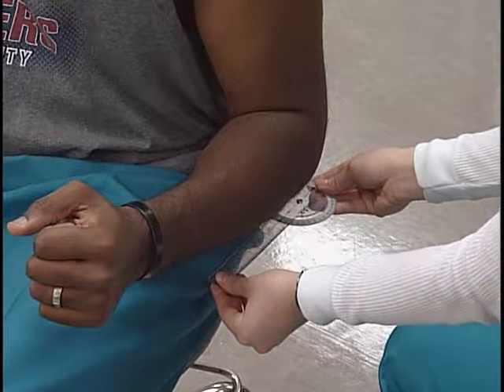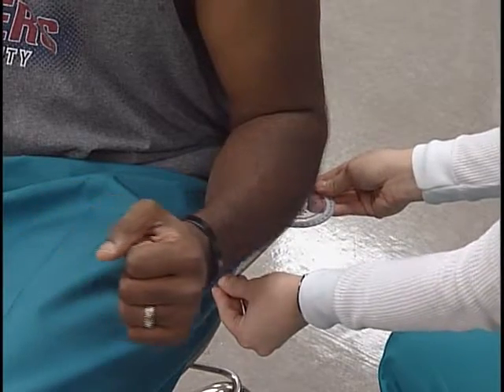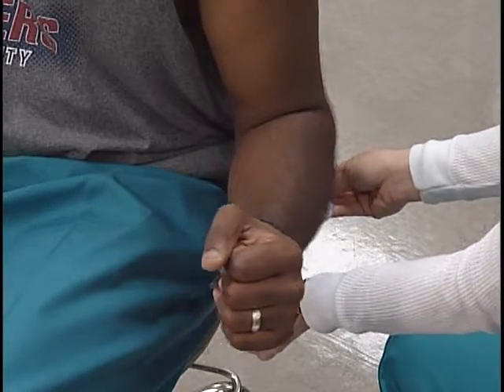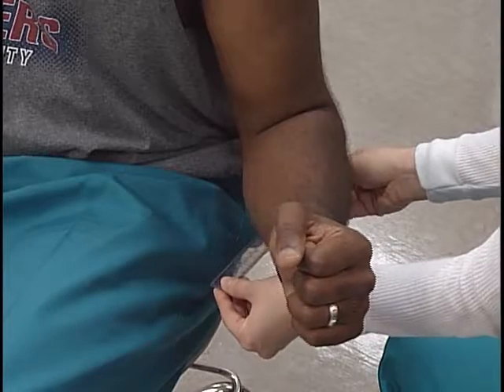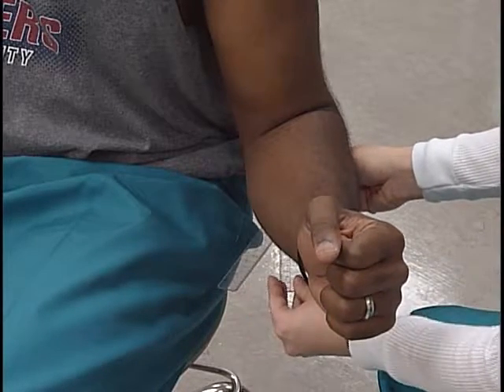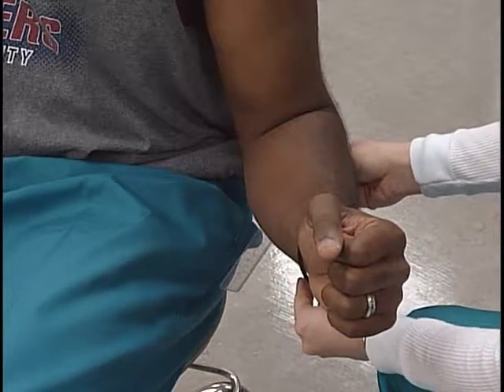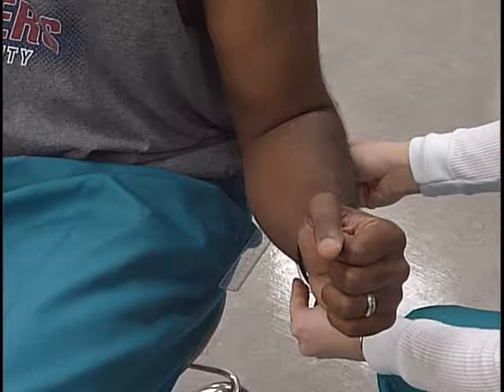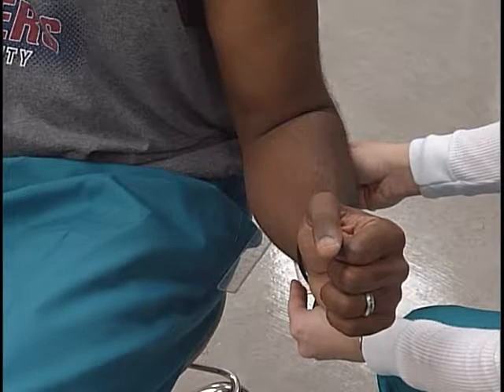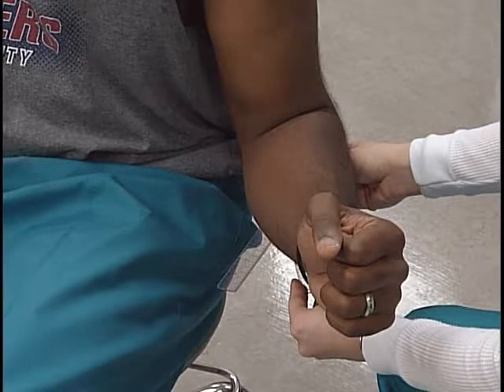The client's forearm is swung out from the body through a horizontal plane of movement. The humerus must remain adducted. The measurement begins at zero degrees and ranges up to 80 degrees.